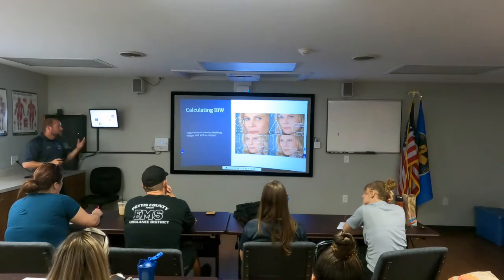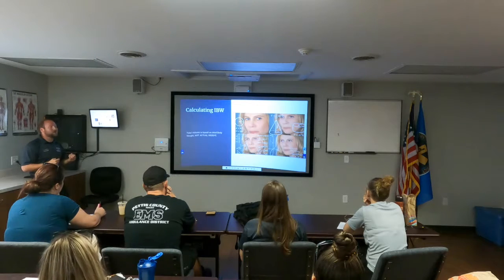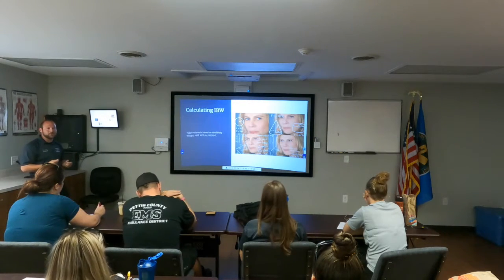Okay. One of the biggest things when it comes to our initial setup is that we are always going to talk about calculating our ideal body weight.